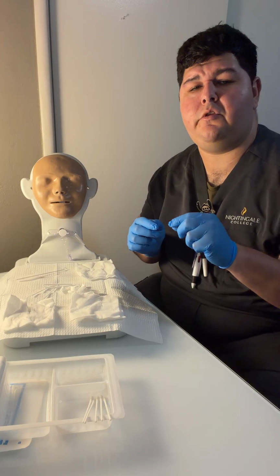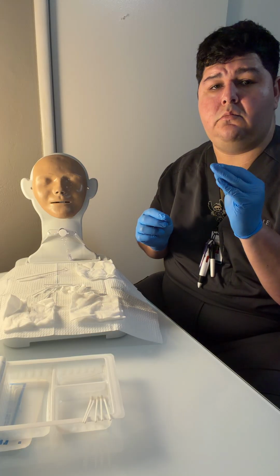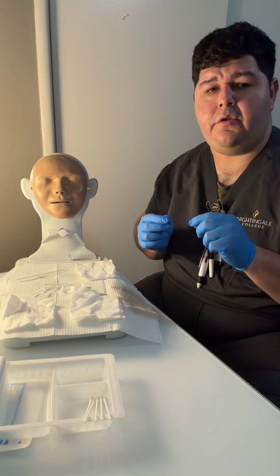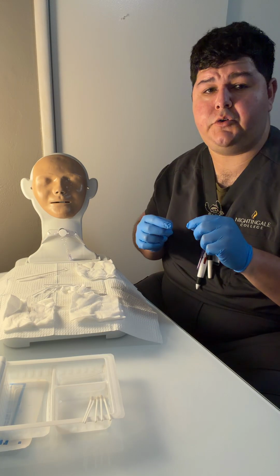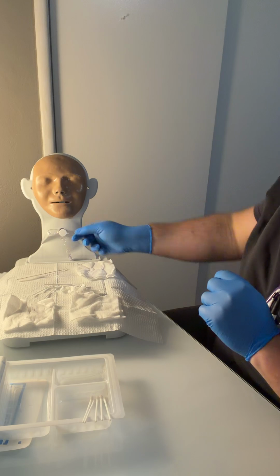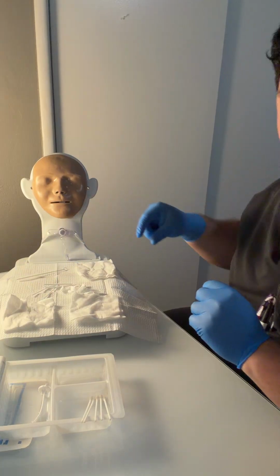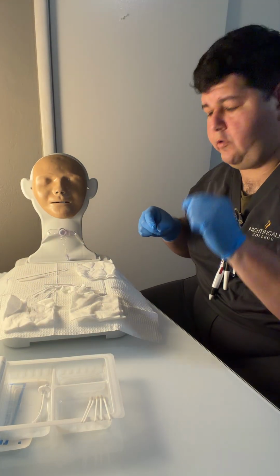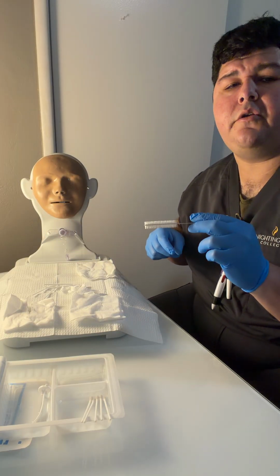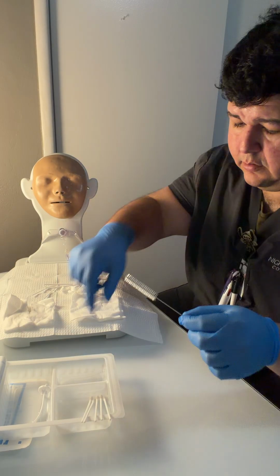I would go ahead and then place the Q-tips into the saline. Once I start touching the patient, I'm going to use one hand for the cleaning, the other hand for the patient. We're going to unlock the inner cannula and then remove it with the curvature of the trach. And then we're going to place it into the soaking solution. I'm going to grab our brush with the sterile hand and clean our inner cannula and scrub it and place it into the normal saline again and let it soak.